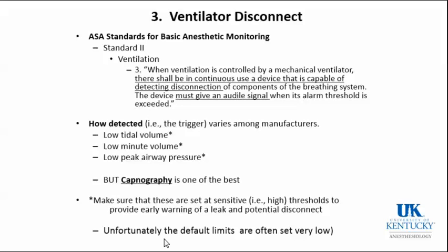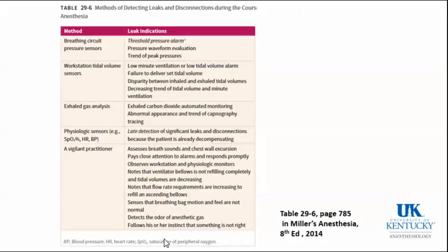And almost daily, I see disconnect events occurring, and it's something that we need to be aware of at all times. This is from Miller's talking about methods of detecting leaks and disconnection.